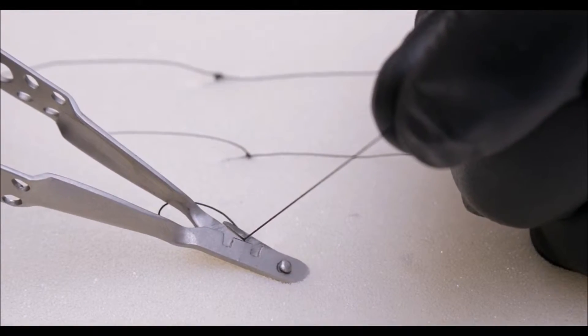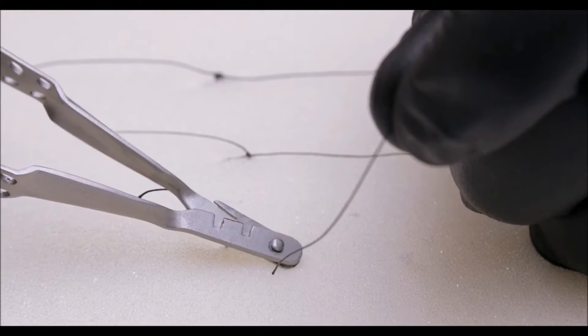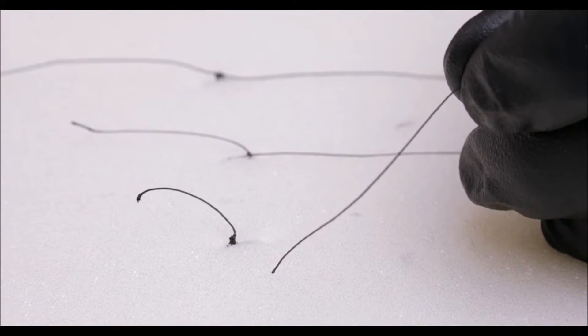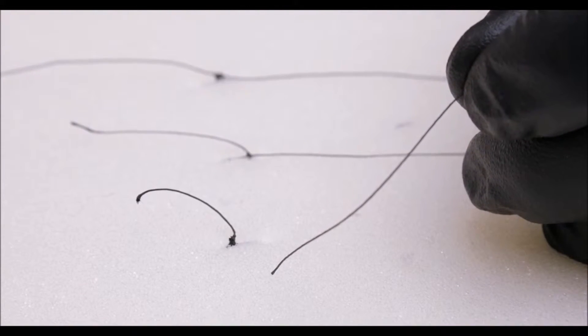Once the knot is tied, simply catch the suture in the slot, slide it down to the knot and gently squeeze, leaving perfect millimeter tags every time without any risk to the patient at all.